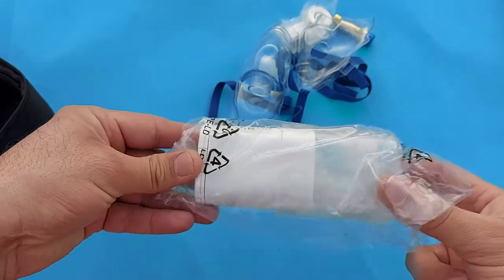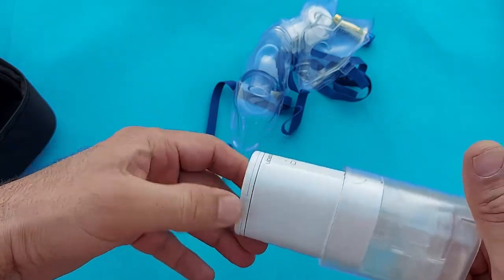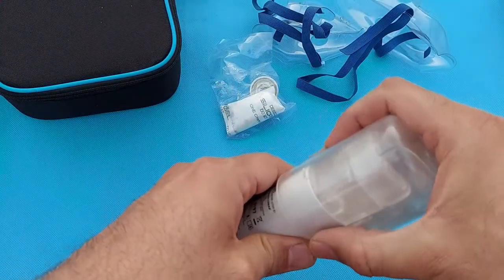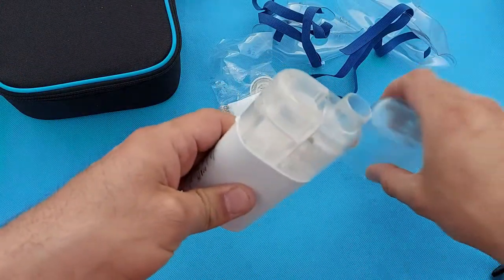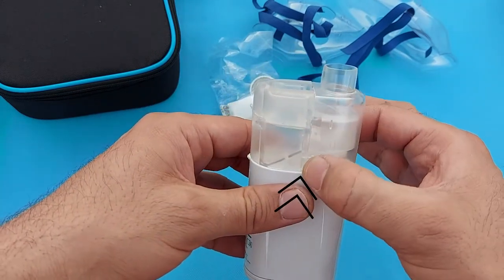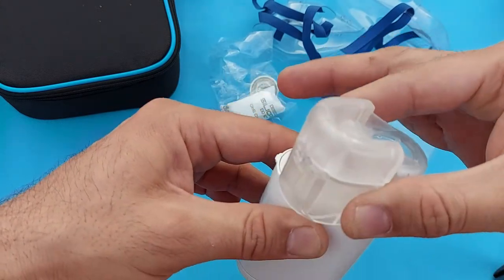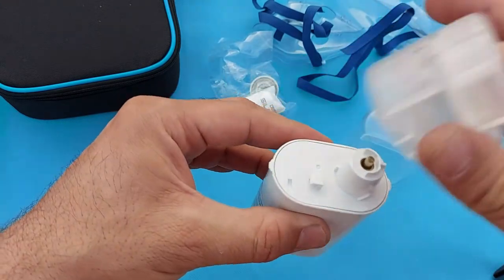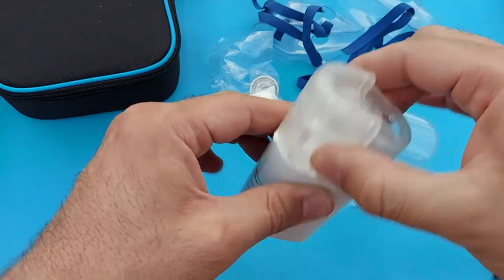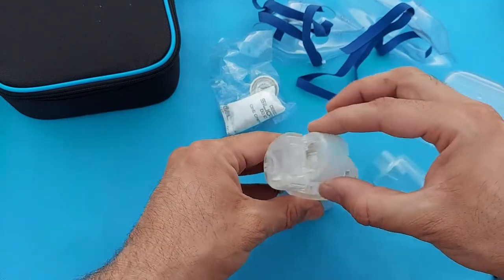Let me show you this device — it is enclosed in a plastic case. We will open this by pressing here, as you can see in the video, and this part will be removed. By rotating this one you can remove the medication container as well. This is the medication container.